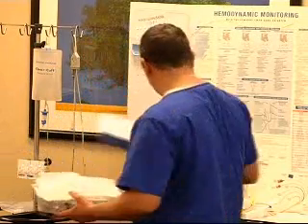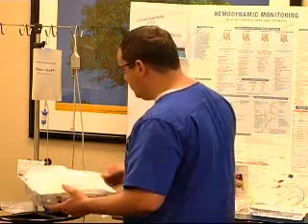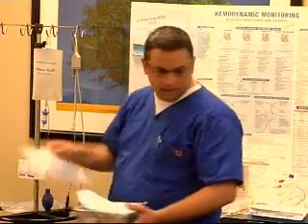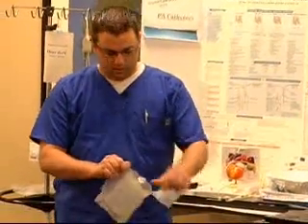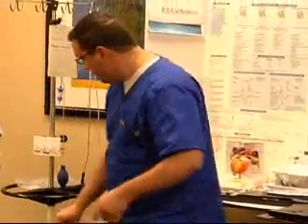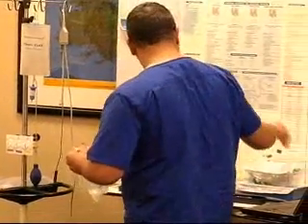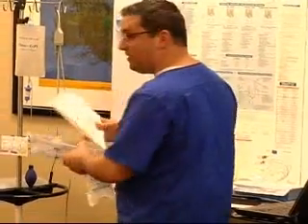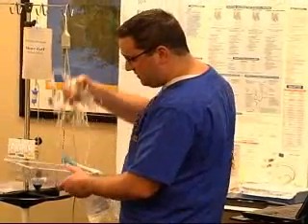So, all right. What are some of the things you could do as far as setting up your lines beforehand? It's always a good idea to prime your setup. Don't throw trash on the floor, but since I don't have a trash can, that's what I'm going to do. When you take this out of the box, this is the trifurcated set.